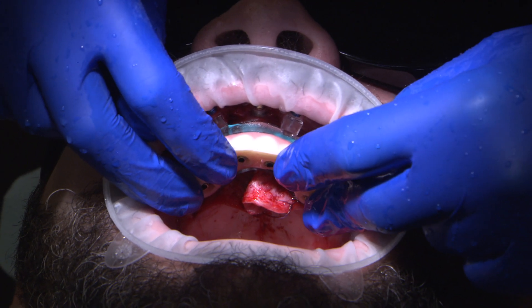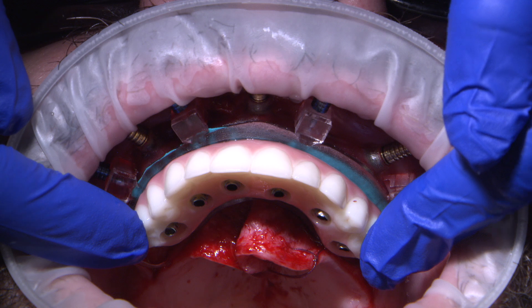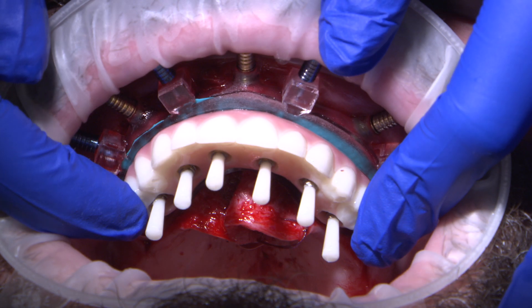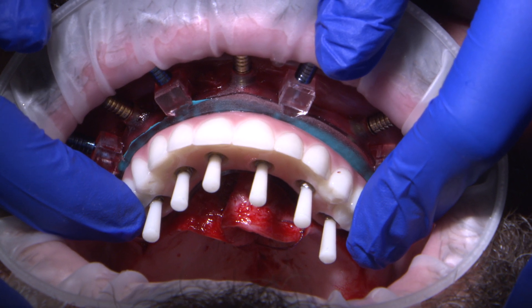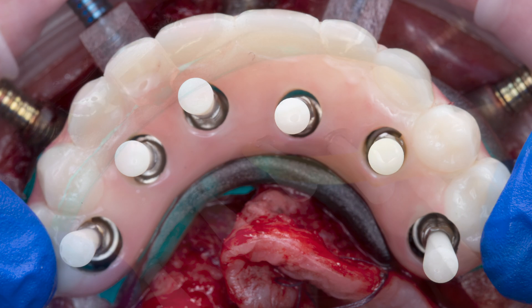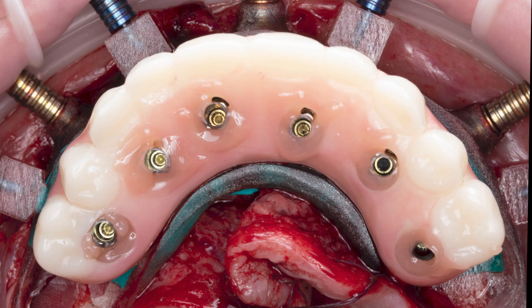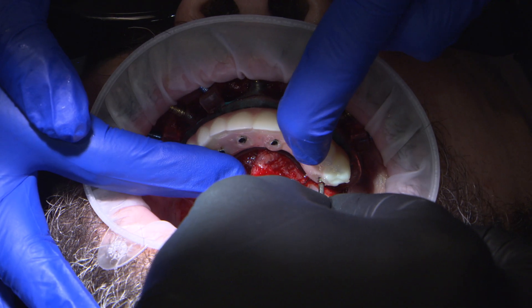The immediate provisional is seated onto the prosthetic delivery guide. There should be a minimum of one millimeter of space around each of the titanium cylinders to ensure it passively seats and there is adequate room for additional pickup material. With the prosthesis in position, the blockout shims, which are also included, were inserted into each titanium cylinder. This step prevents any acrylic from accidentally covering the screw head or the access channel during the pickup process. The pickup material was then flowed into the acrylic channels located on the buccal, lingual, and occlusal surfaces, securing each titanium cylinder to the immediate provisional prosthesis. The prosthesis with the louted titanium cylinders was then removed from the mouth and adjustments were finished in the lab.